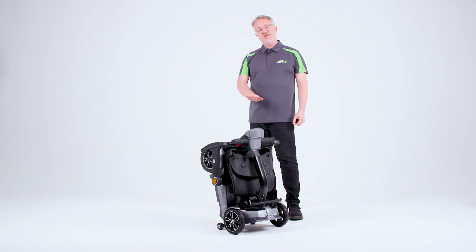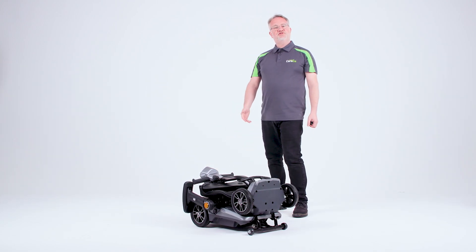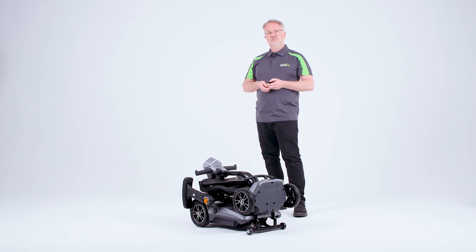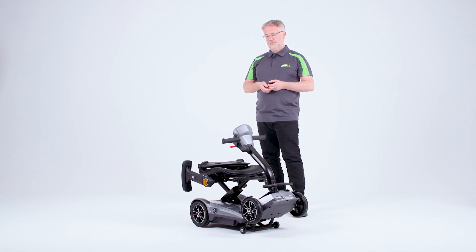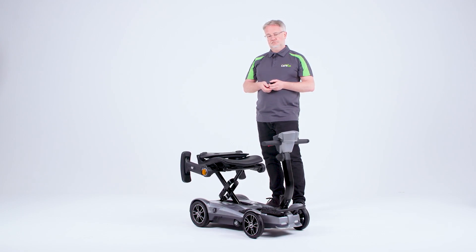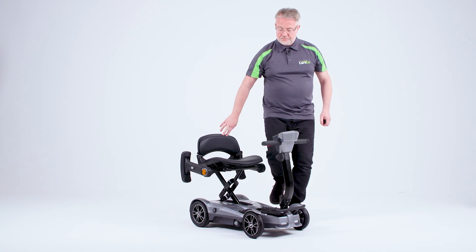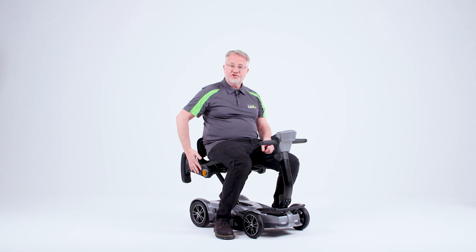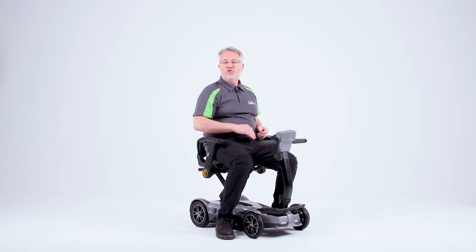In order to unfold the X-Go Nano, we need to place it onto its rear wheels. Once in this position, we can now use the fob or the buttons at the rear to open it out. Once unfolded, we just lift the backrest. We can sit on the scooter and now we can adjust it for the height of our arms and also lift the armrests up. Simply press the button on the side and repeat on the other side.